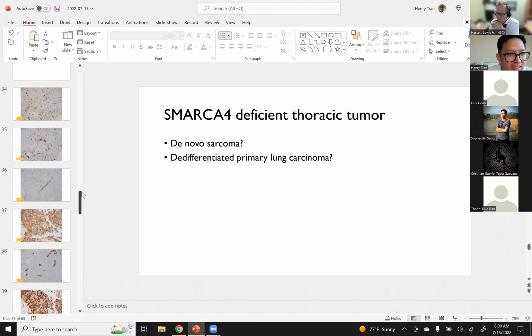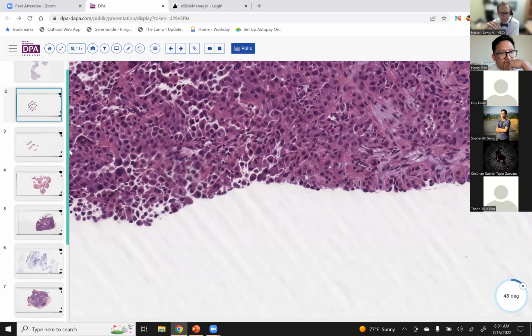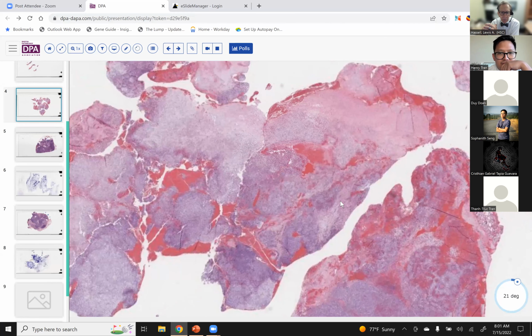So we run into this issue in endometrial and ovarian tumors as well, where you have a very high-grade tumor and it doesn't stain with the usual markers. It's lost PAX8, it may have lost other things, but maybe has a little patchy EMA or keratin remnant and so forth. Sometimes you see it in association with a lower grade, well-differentiated tumor, and so we call it dedifferentiated, but it's really just a very high-grade, undifferentiated carcinoma that has lost SWI/SNF capability, either through INI1 or SMARCA4 or some other component of that apparatus. So I think it's not unlikely that we're going to continue to see this category of tumor unfold in other areas, and we'll come to understand it a little bit more.